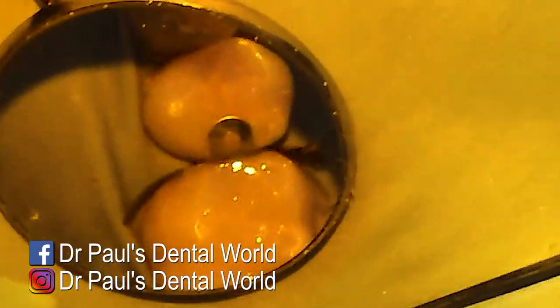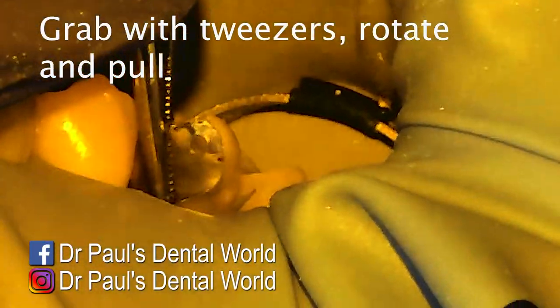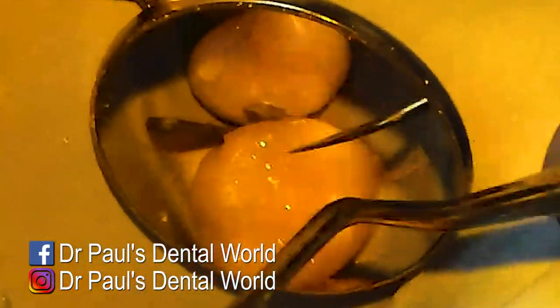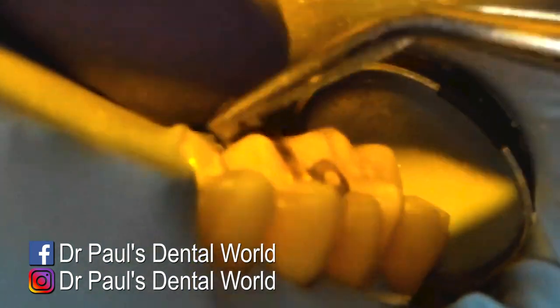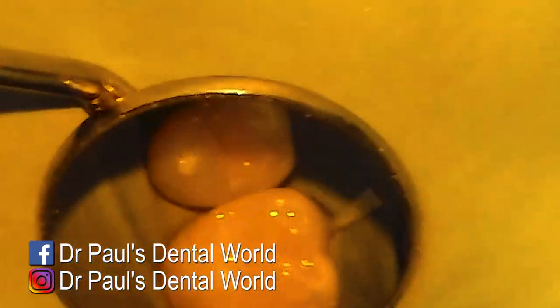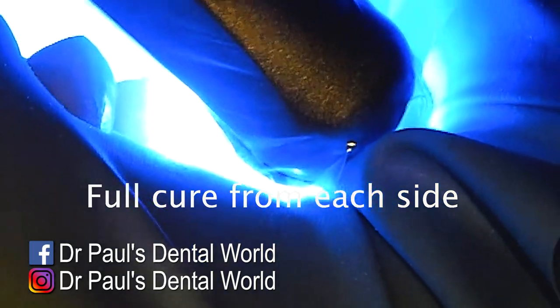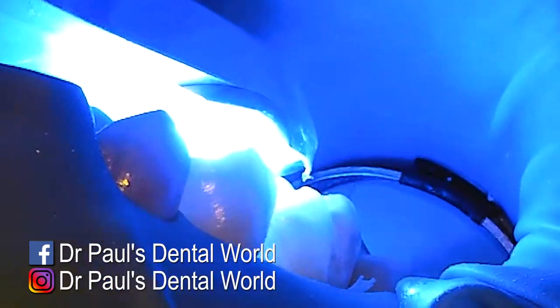Once we've finished curing, I'll take everything off and take out the sectional matrix. My little trick is to grab onto it and twist it at the same time, but unfortunately it rips because the matrix is attached to the resin. So I use my flat plastic to detach it from the resin, and then when I come to grab it with my tweezers it does come out — grab, twist, and pull at the same time. Then I'll do a full cure on the buccal, the occlusal, and then the palatal.